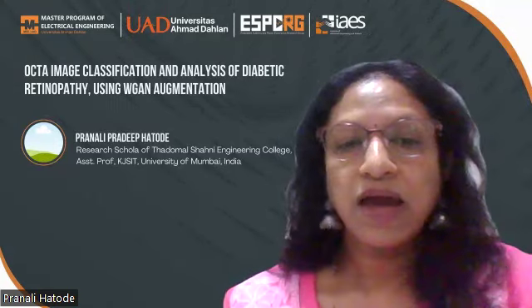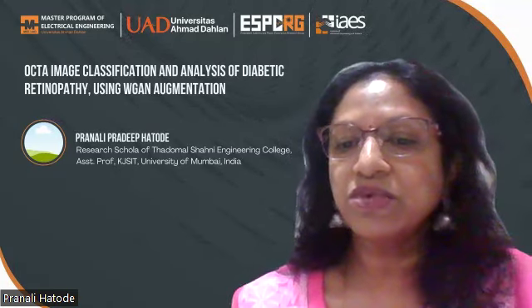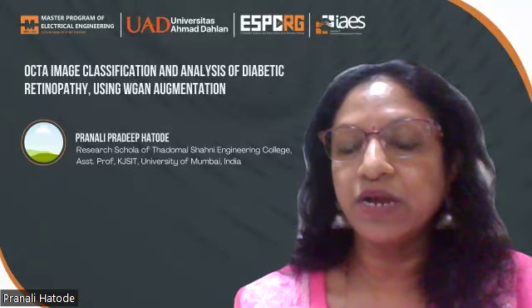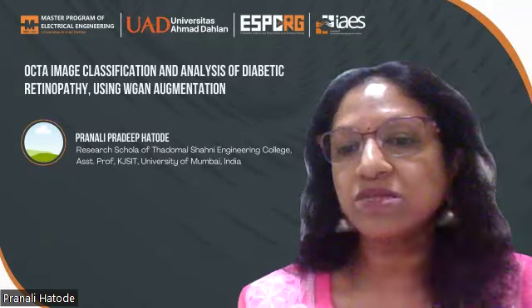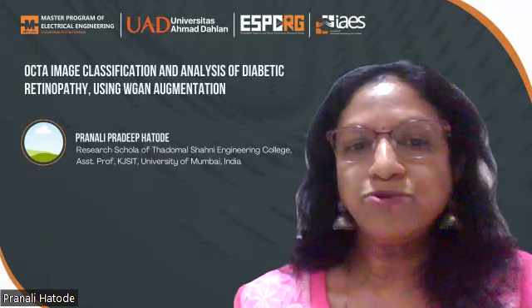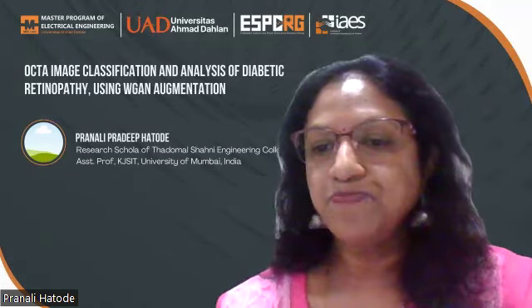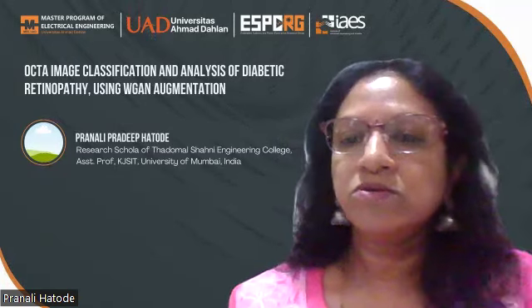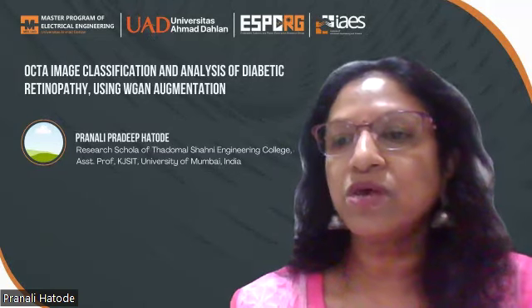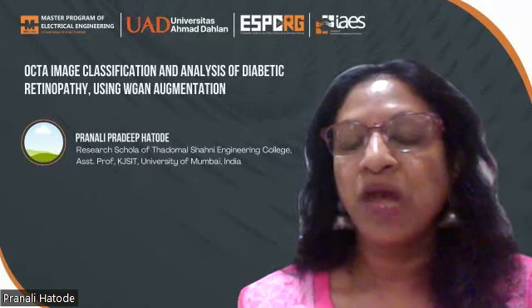To avoid this, I chose ResNet 50, because ResNet 50 is capable of overcoming this disadvantage of gradient loss because it has skip connections. With skip connections, we are able to use all the weights of the model without losing the gradients. So ResNet 50 was operated on GAN generated images, and it gave me 62.48% accuracy.